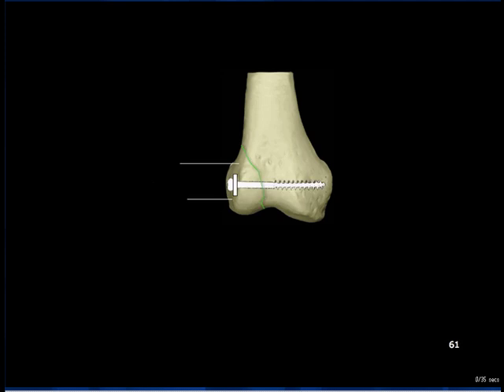As the screw is driven home, the tip creates the thread in the bone by impacting it aside. There is no need to drill the cortex to 4.5 mm to accommodate the shaft. This will enter the bone with ease once the 6.5 mm thread has been created. As the screw is tightened, the fracture plane is compressed. Cannulated cancellous screws are available and can be used, a guide wire being inserted instead of one of the Kirschner wires, at the stage of temporary stabilization after reduction.